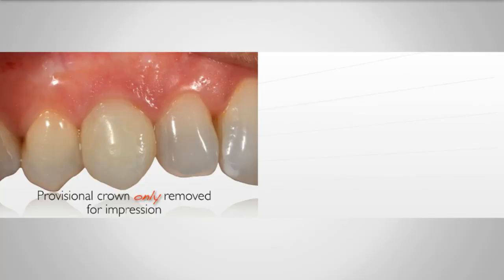If I'm not using a performance post, am I using a gingival abutment? I haven't used a gingival abutment for a long time. I'm pretty much sticking to the performance post. You could use a gingival. I think it would work fine.